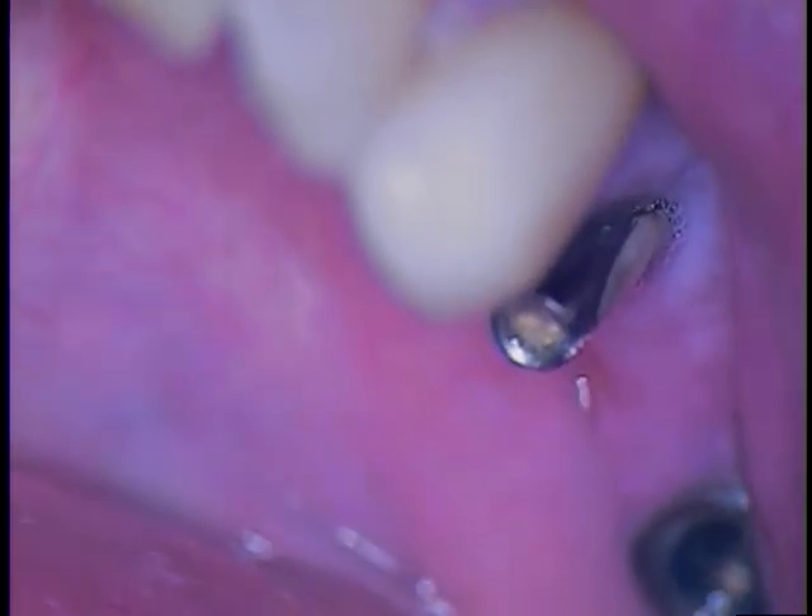So that's the anterior. Assuming that's correct, the possibility exists that the distal abutment is also a standard stock abutment. I'm going to go in with soap and a small brush and scrub the inside of this implant. We're going to do an investigation of a wide neck implant.